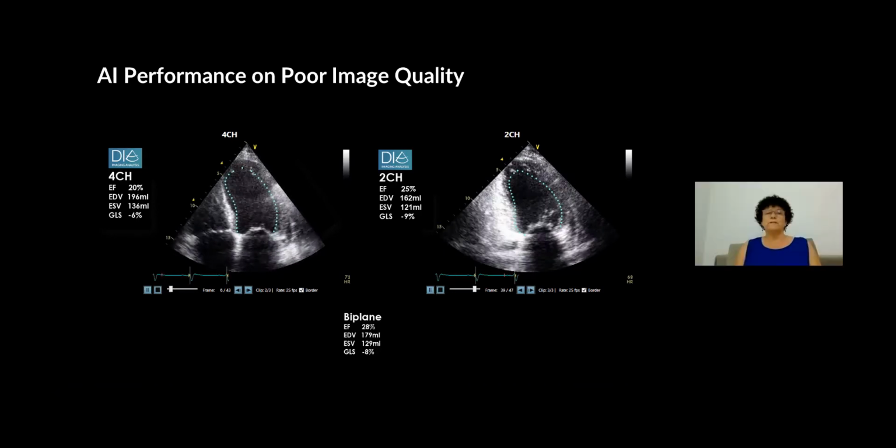Thank you, Dr. Goldman. And I'd like to ask now Dr. Feinstein, to what extent do you think AI would impact echocardiographers' decisions? How do you visualize it in the next few years? Thank you very much. As Marty said, this automated software will be implemented within our reading systems. It'll be transparent. It'll be simply an add-on that we don't have to search for. So it will provide us a second opinion as we're reading the echoes without causing additional time or offline analysis. It'll be a huge boon to all of us. So that's the immediate gain.